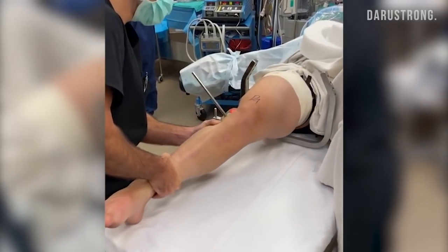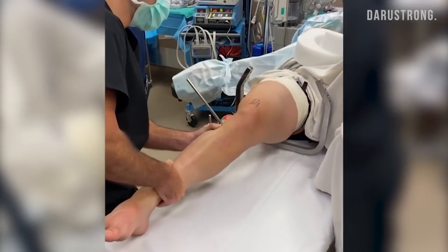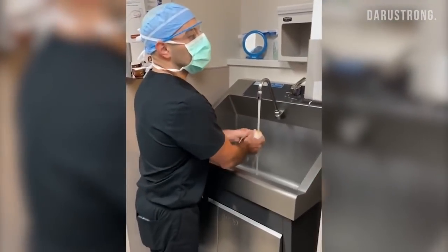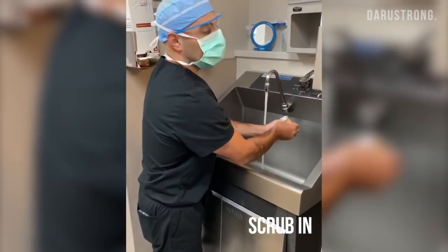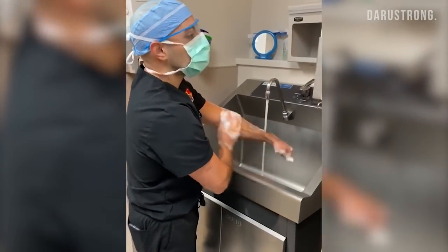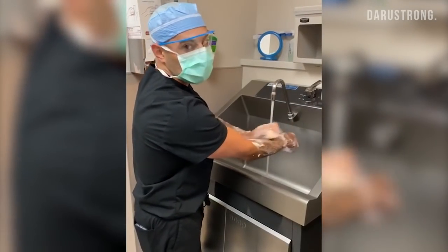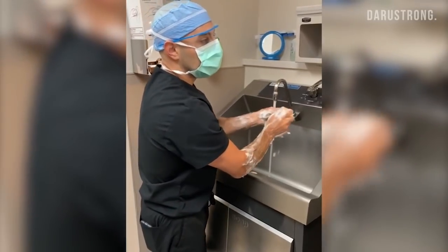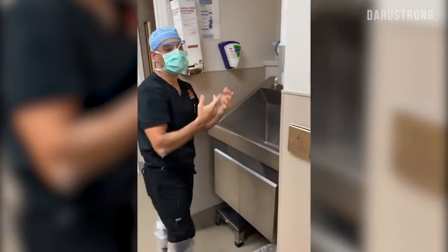It slides right there — the increased translation. No doubt about it, definitely a torn ACL. So we're getting ready to scrub in here for Phil's surgery. We're going to do an ACL reconstruction. Phil's a very active guy, obviously he's going to test his knee, so we've got to make sure we get a really strong ACL reconstruction. We were talking about graft choices. I thought the patellar bone-tendon-bone graft, given his age and activity level, was the most appropriate. Alright, here we go.